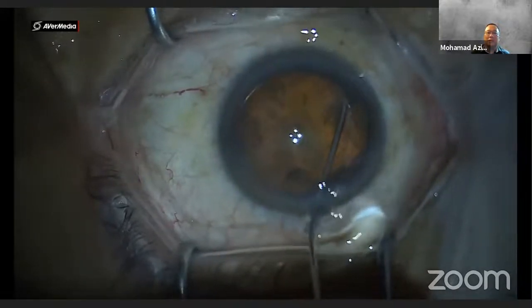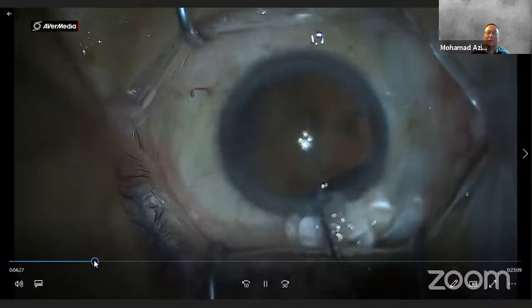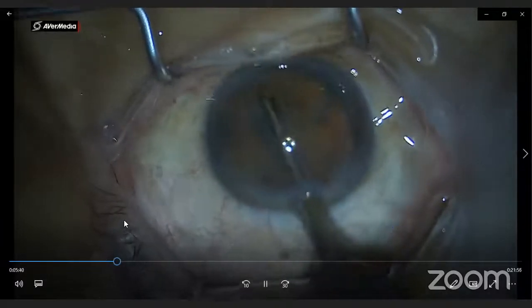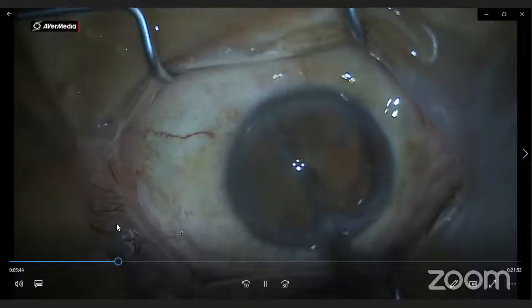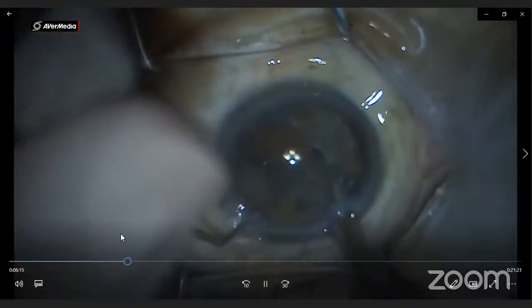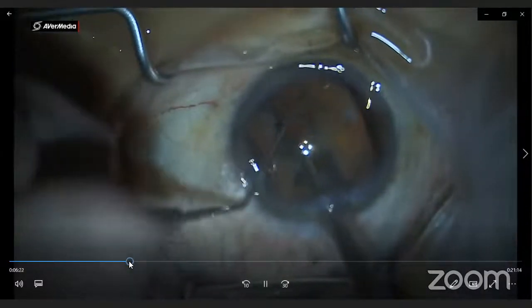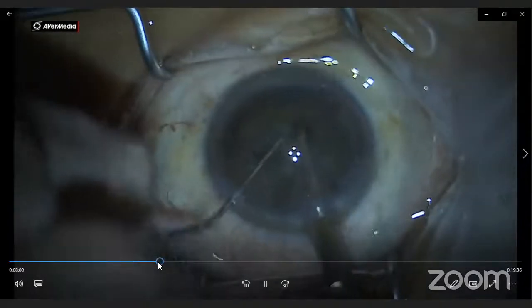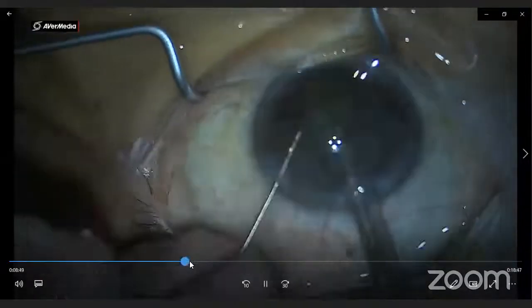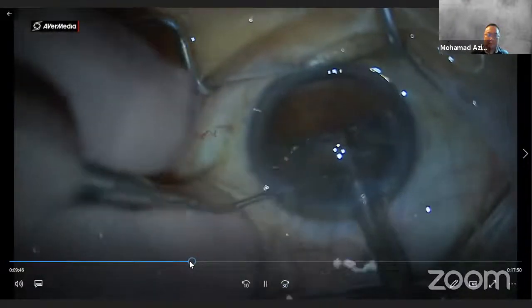We go direct to the issue lah, the one that you have problem. Actually tak ada isu sangat. Boleh jadi this one you can do kan? Yeah, this one actually saya buat divide and conquer, Dr. Aziz. So masa ni tak belajar lagi chop. So next time I hope I could chop more. Dia actually tak ada isu sangat. Okay je divide and conquer kan, tak ada isu. Yeah, the cataract pun not that dense.